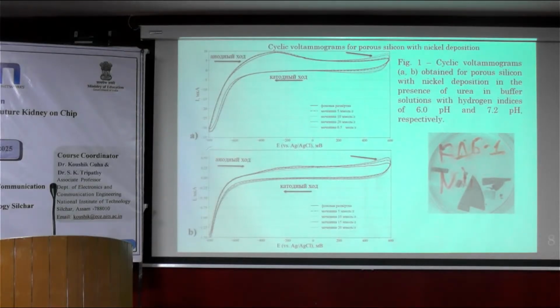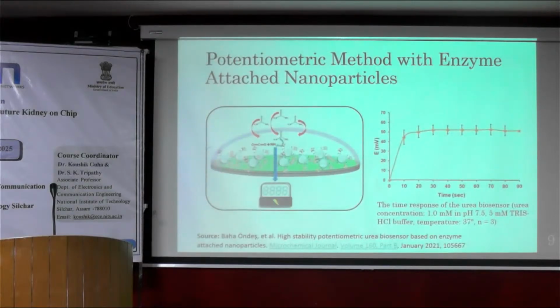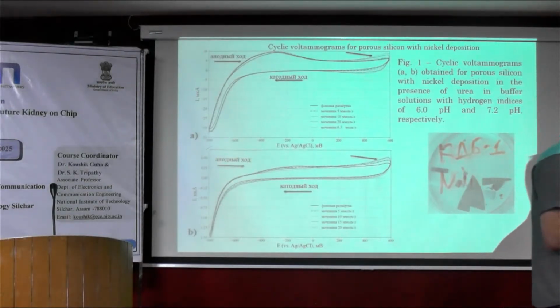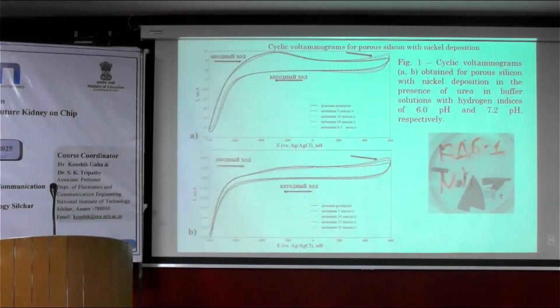And we have to take into consideration that if we have a strong albumin presence, it could be an issue. So cyclic voltammetry is a potential method that can be used for biosensor application. It's more like just a sensor. This is a biosensor, but multiple issues have to be taken into consideration when we work with that system.